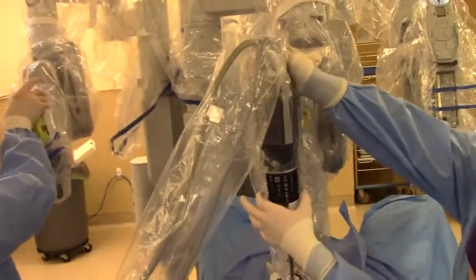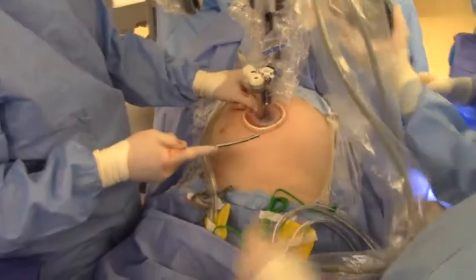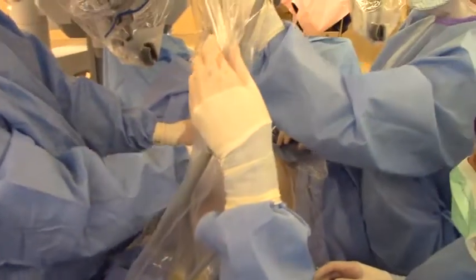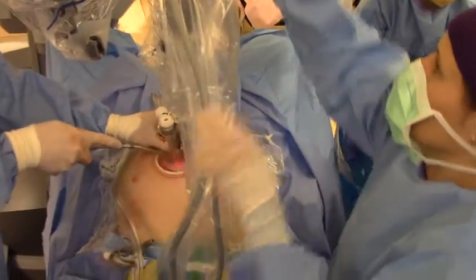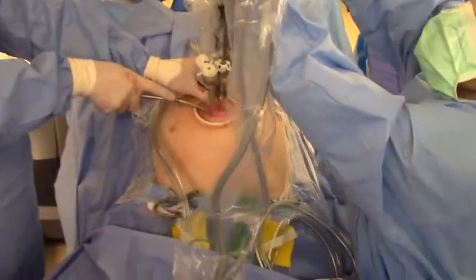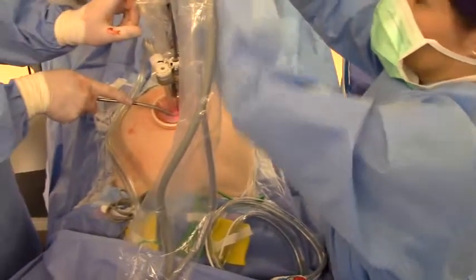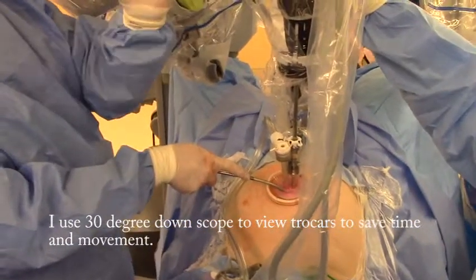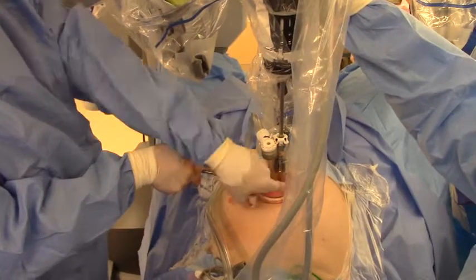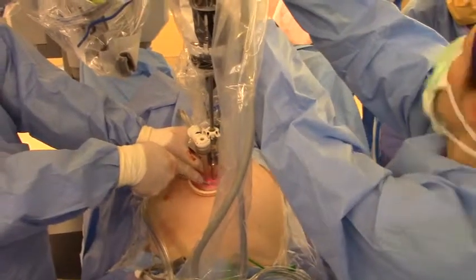This is a dock assist. So I start this with 30 down — I'll tell you in the class to do 30 up, but I decided it's another movement you have to make. The buttons are facing me because this is looking at the other side since I'm crossing over, and my tip is going to come in there. So I go straight across and you'll see this tip come in the right lower quadrant.